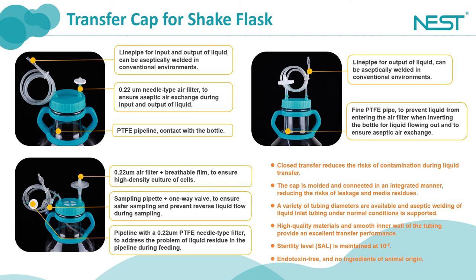Meanwhile, the sampling tubing is equipped with a needle filter. Screw the syringe into the needle filter to inject the liquid remaining in the tubing after feeding back into the flask to reduce waste.